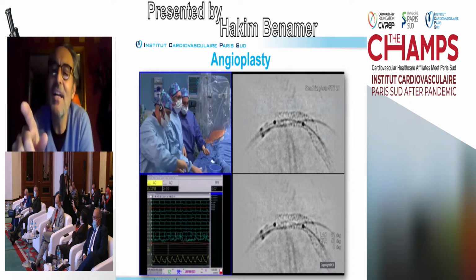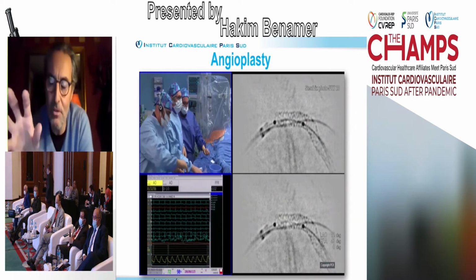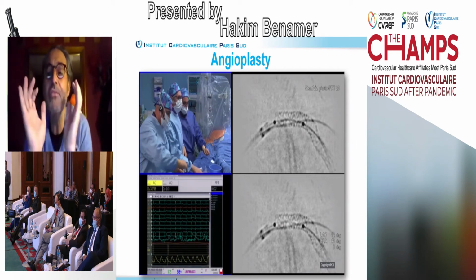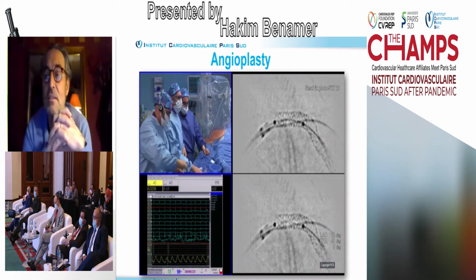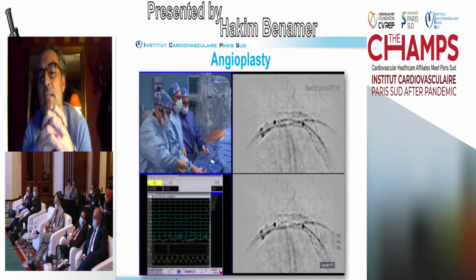That's a very good point, and it's very interesting to discuss. The left main at the ostium was not diseased. That's why we decided not to put the stent on the ostium. But usually, when we have a diffuse left main disease, we of course also cover the ostium.